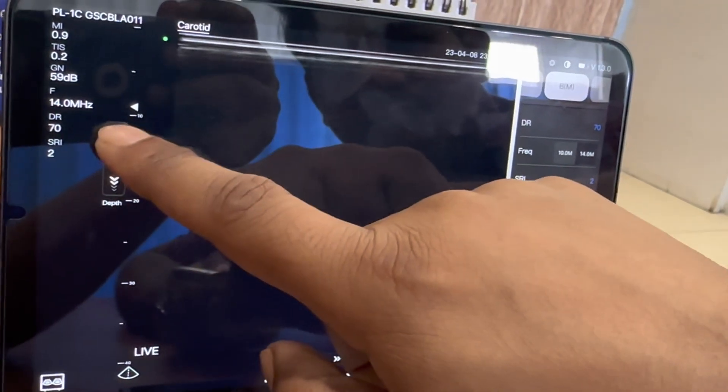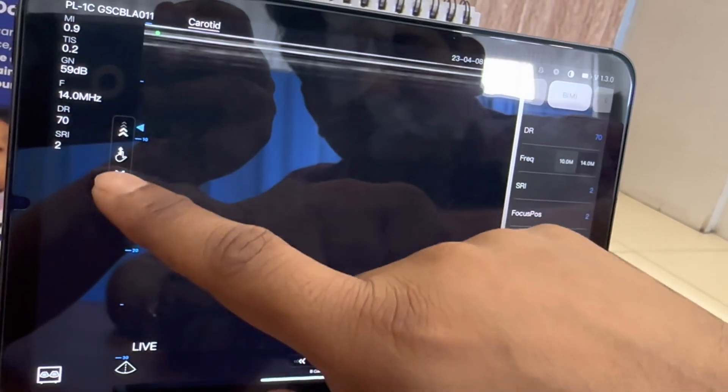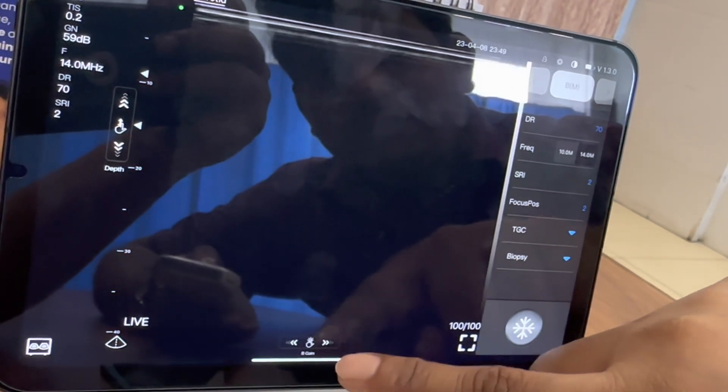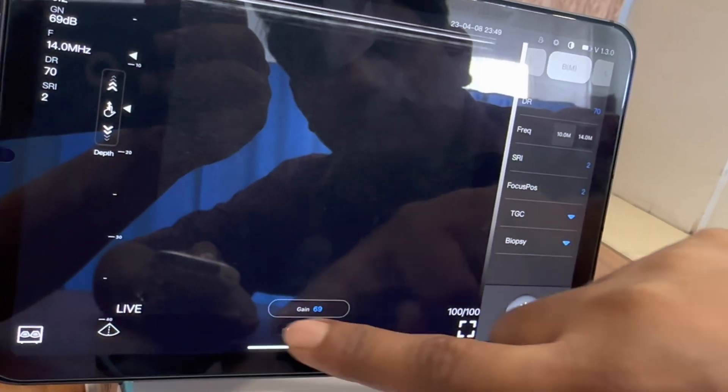By swiping up you can increase the depth, and by swiping down you can decrease the depth. By swiping right you can increase the gain, and swiping left you can decrease the gain.